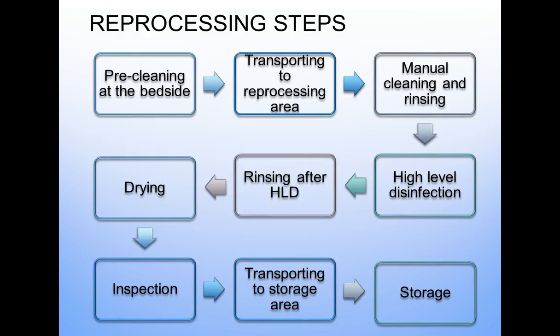And then there's a table just to describe the reprocessing steps. And here we talk about pre-cleaning at the bedside. So whether it's yourself or a physician or another assistant, it's important that everybody is trained at how to perform the pre-cleaning at the bedside. Then you have to transport your device to a reprocessing area, and the device should be contained when you're doing that. Manual cleaning and or automated, but most often we use manual cleaning and rinsing.